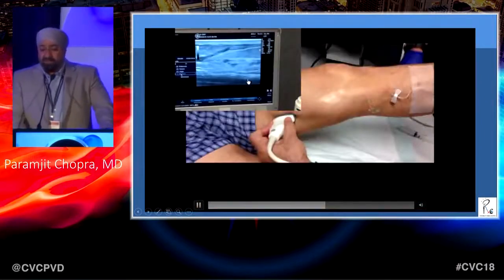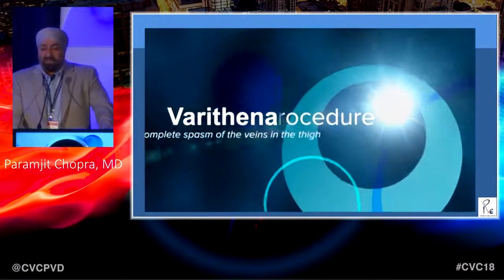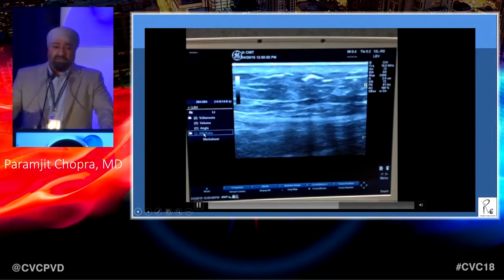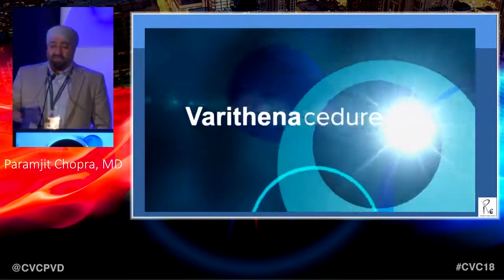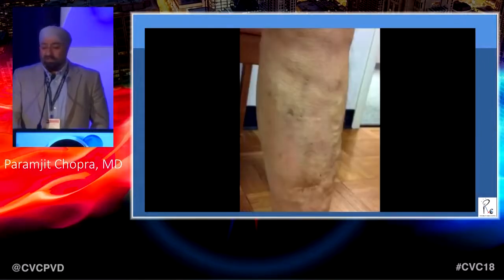And while I'm injecting at that point, I want to be extra cautious. Yes, they say nothing happens if it goes deep, but I compress that with the ultrasound. Then I make sure there's complete spasm of all those branches. I actually keep that leg elevated a good 10, 15 minutes. We put a wedge under that, a big foam wedge. We let it empty out, let the chemical act on the vein per se.